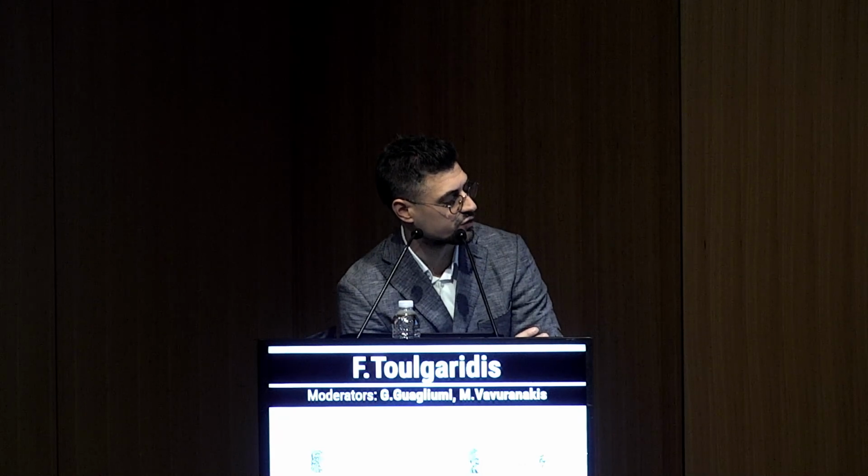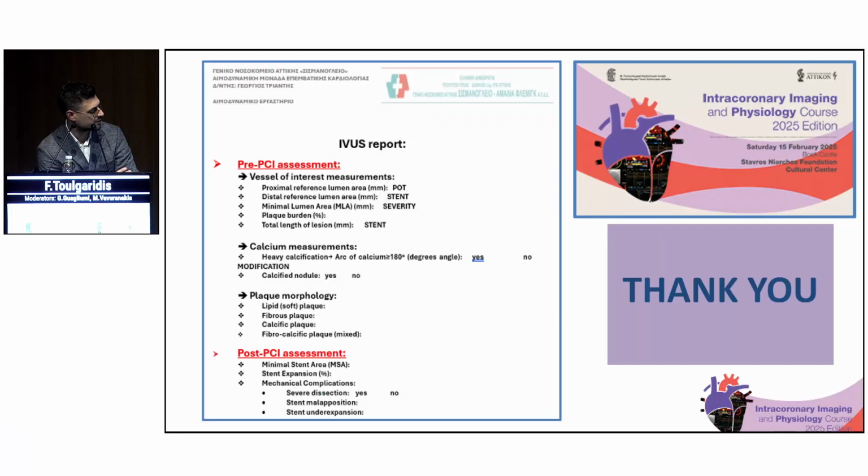Okay, we will have Dr. Milasinovic to conclude the case. And before I leave, this is the automated IVUS report we use in every case regarding IVUS-guided left main PCI on site. We do this quite quick check. It lasts about 30 seconds, and we know roughly what to deal with during left main PCI that we use IVUS in our cath lab. Thank you very much.